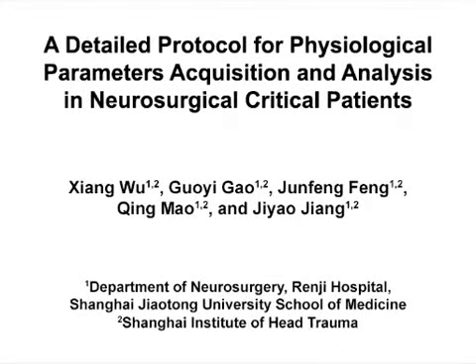The overall goal of this procedure is to acquire and analyze multiple physiological parameters in neurosurgical critical patients. This method can help answer key questions in the clinical data monitoring and analysis field, such as mean ICP value, ABP, and the ICP-derived parameters. The main advantage of this technique is that it can easily achieve long-term, high-frequency multiple data acquisition and analysis.